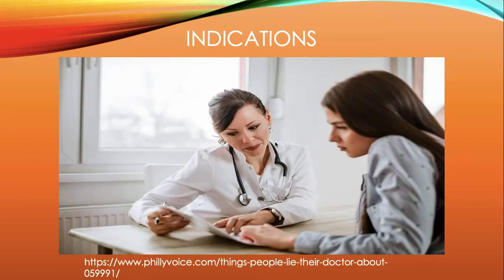So now we have our indications. These are reasons why you might have an IOC. Like I said, IOC is to help identify any bile duct stones, clarify biliary anatomy, and to help prevent any injuries to the bile duct.